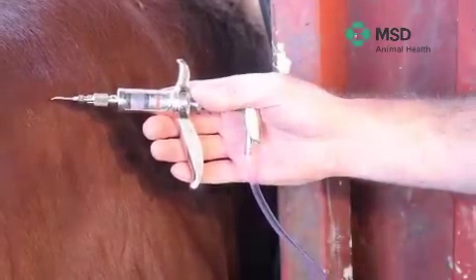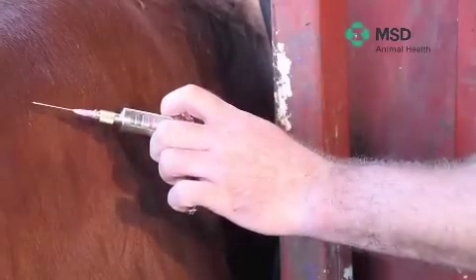When we administer the intramuscular injection we usually use a larger needle — either a three-quarter inch needle or a one and a half inch needle.